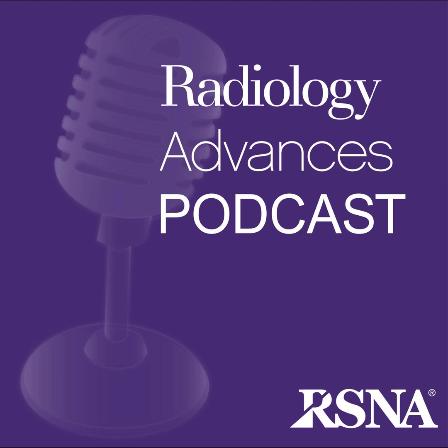Today, we're doing a deep dive into something pretty intriguing, the idea of spotting a pulmonary embolism, a PE, through CT without needing intravenous contrast. Think about those patients where contrast is a definite no-go. You know, the ones with really poor kidney function, or maybe they've had a serious reaction before. So what if you could still get meaningful information about PE in those tricky situations? That's what the paper we're looking at today explores.